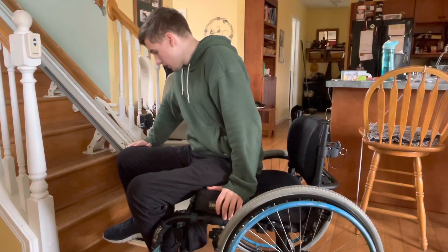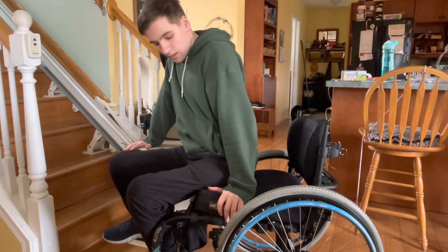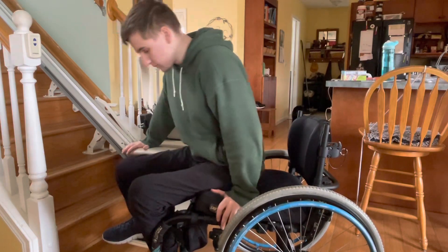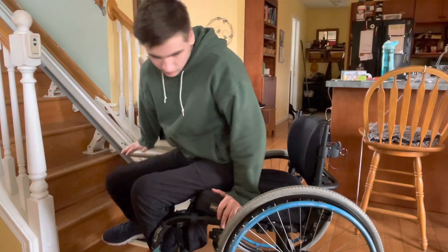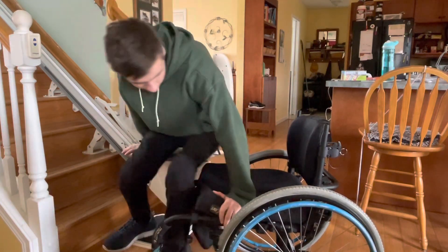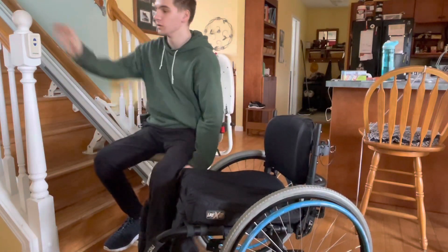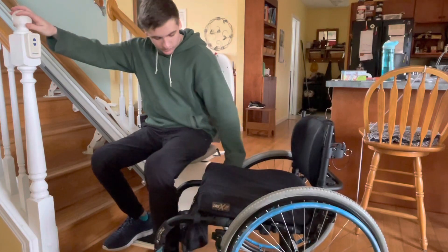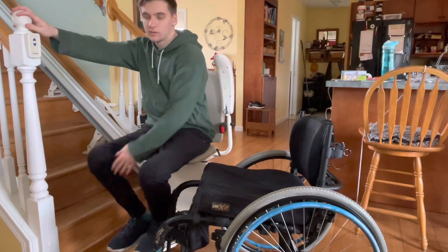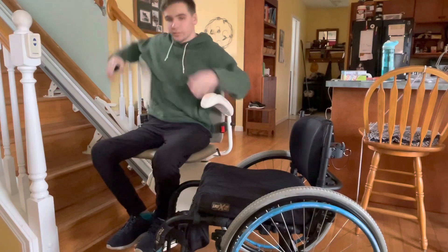My head is over to where I want it to be, and what I'm going to do is push up and then rotate my butt — I'm not going to try to slide so much as I'm going to try to turn this way. When I push up and turn, my butt just naturally goes onto where I want to transfer to. Then from there, getting your other leg over, readjusting, and I'm ready to go up the stairs.